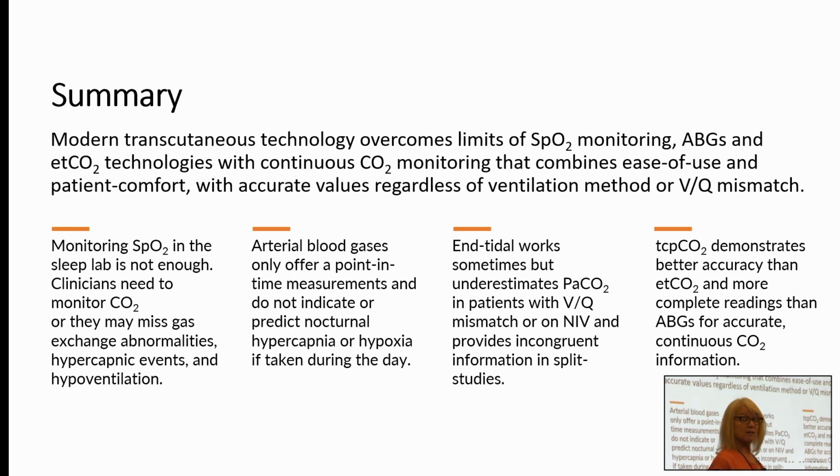End-tidal works well in some situations. It can be adequate, but it does underestimate the CO2 in those patients with a VQ mismatch, also in patients who are on non-invasive modes, and it fails to provide great data when you're doing a split-night study.